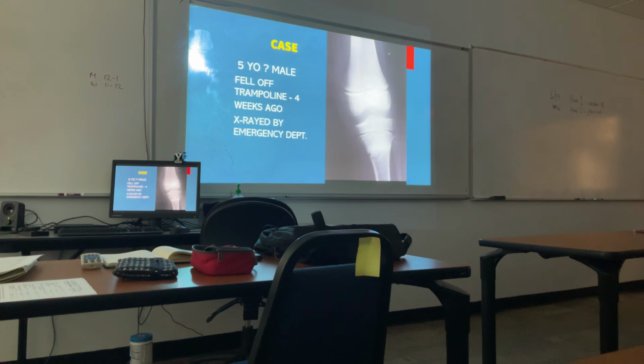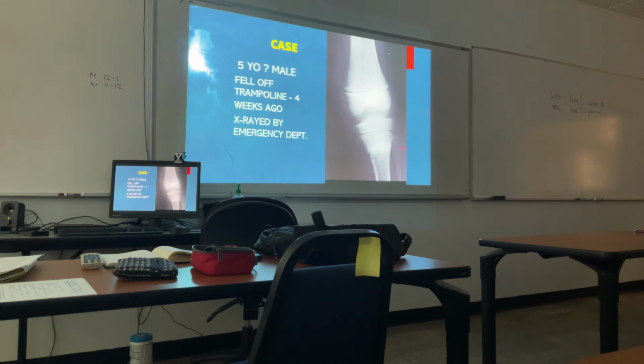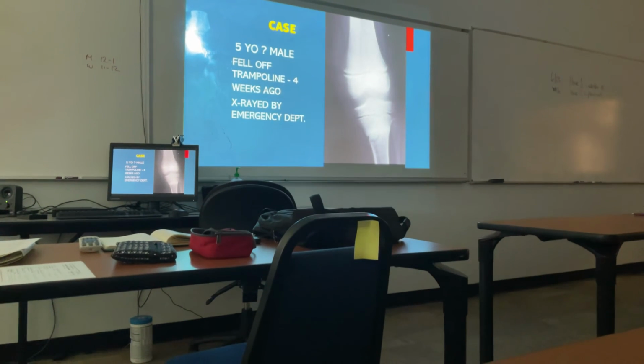Well, I'd say, okay, I'll take a quick look at this. This is fine, but I can't use this. This has to be redone with more collimation, with markers, because this isn't over. I have to do the follow-up films to make sure this is healing. If it doesn't heal, now it goes to an orthopedic surgeon, and he looks at my x-rays that are not good quality, and he says, damn chiropractors. I don't wanna hear that. I wanna see, these are the best x-rays I've seen from a chiropractic physician. I think I might refer my patient who has mechanical back pain to him.